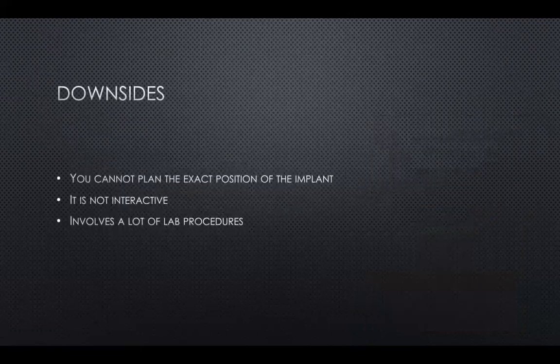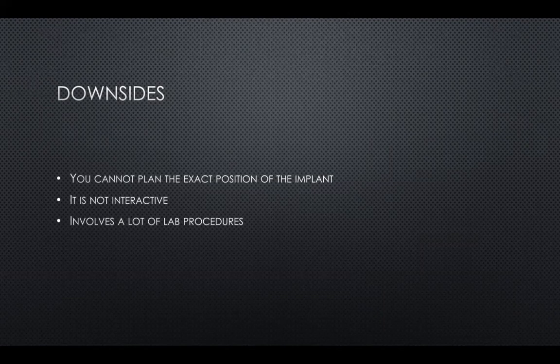What is the downside of this? The problem is that you cannot plan the exact position of the implant. So this method is not interactive. All you have is a tool to analyze how much bone you have, and where the implant is going to be positioned as a general look, but not detailed.